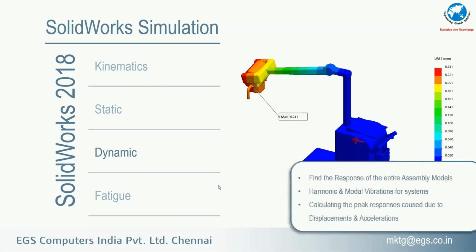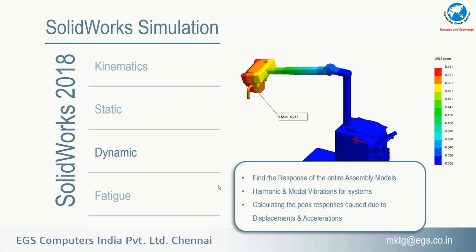So what we are going to do in dynamic analysis is give a G force in a particular direction, which we will consider as an unexpected vibration in the structure. Through this dynamic study, we will calculate where the maximum stress is and how we can handle it. We will choose where the peak areas are and whether we need to give any supportive structure to withstand those unexpected loads.